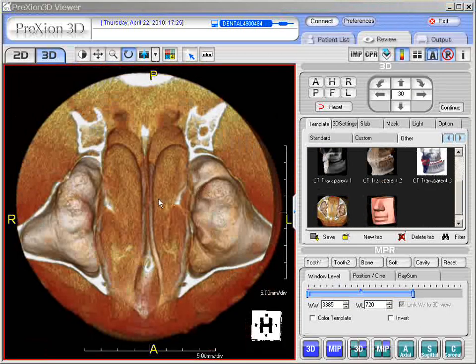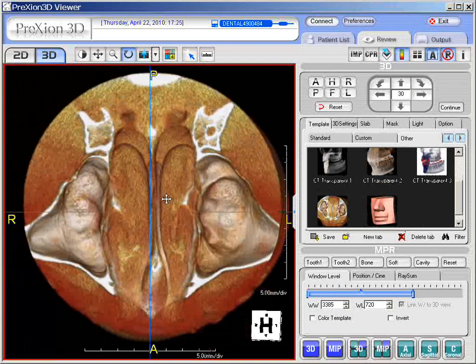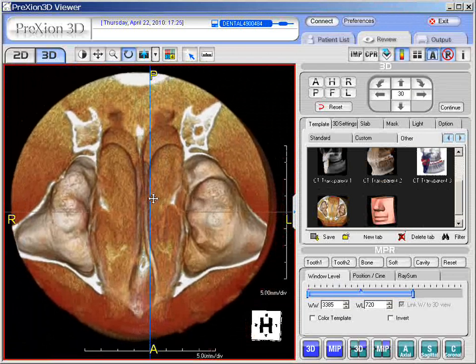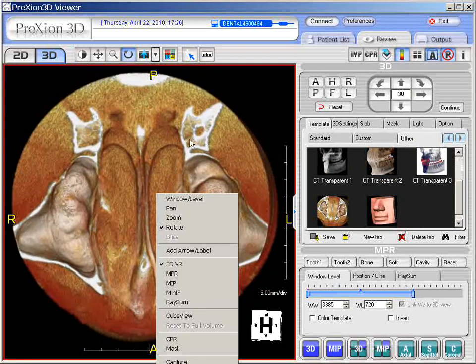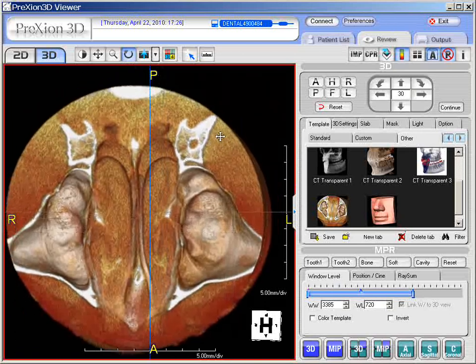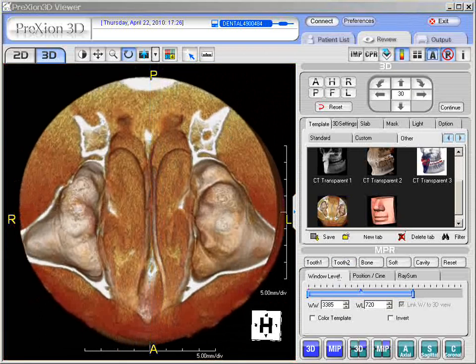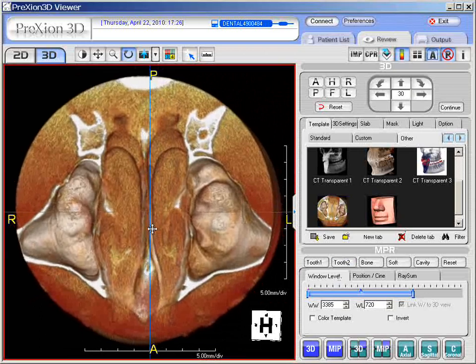For re-centering, press the right click on the mouse and notice the white caliper. When the mouse is moved, you get blue crosshairs. So you can re-center with the right click. The right click also serves as a pop-up menu. If you wish not to use the pop-up menu, just hold the right click down, wait for the white caliper, then move and re-center — re-pan your position. Pan is performed with the right click of the mouse.